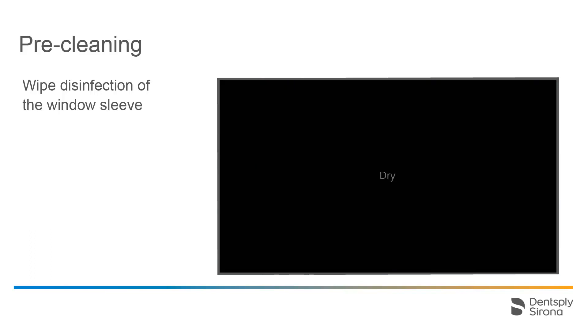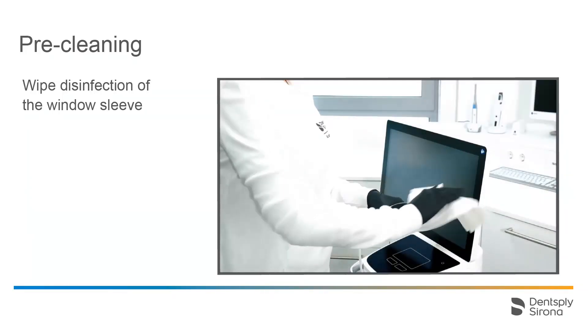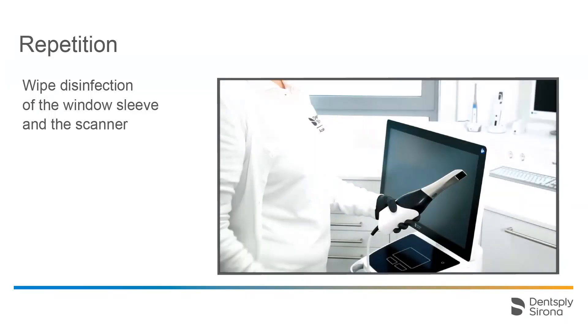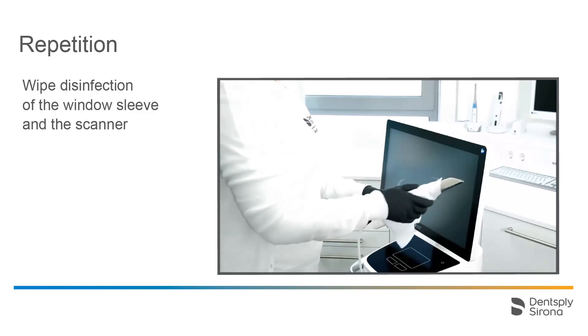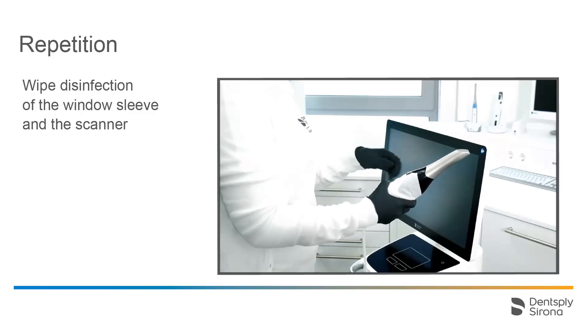The sleeve is dried with a lint-free cloth. This procedure is repeated in the second step, but this time the scanner casing is treated, including the attached sleeve. Both the sequence and the selected materials are identical to those from step 1.